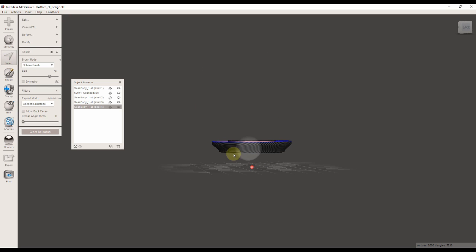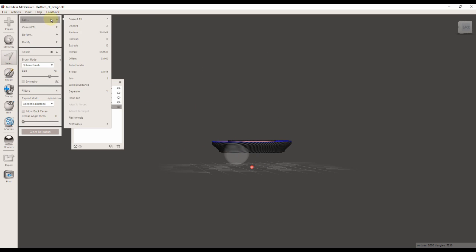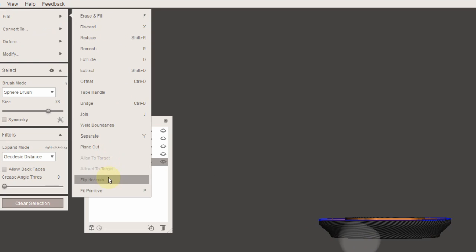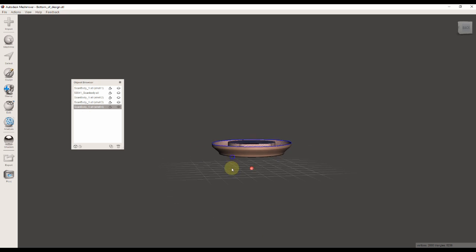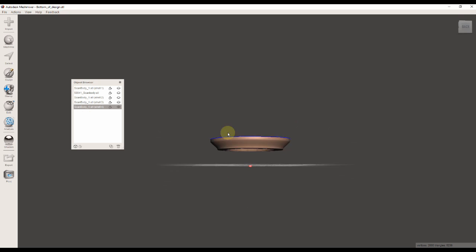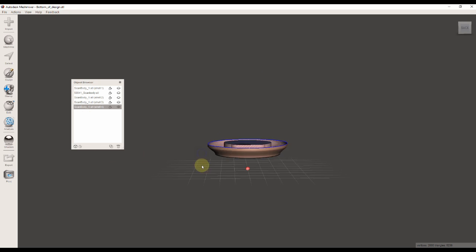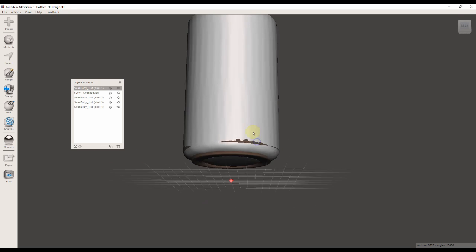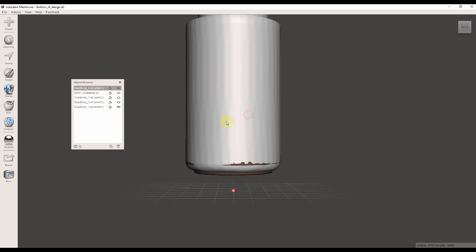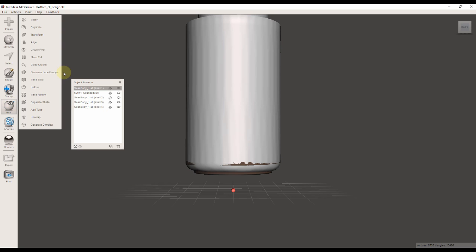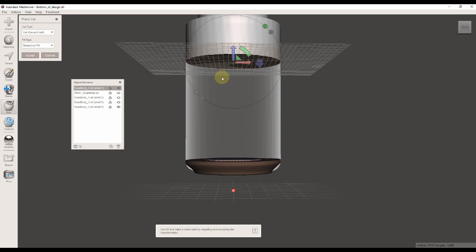You can see it's actually an inverted file, so I highlighted it with the Select tool, and under Edit I'm going to click Flip Normals. The actual scan flag is a little bit too long, so I'm going to use the plane cut tool to cut it down.